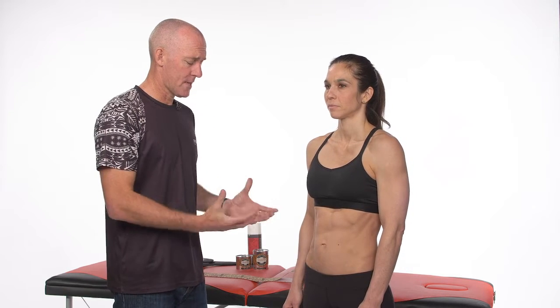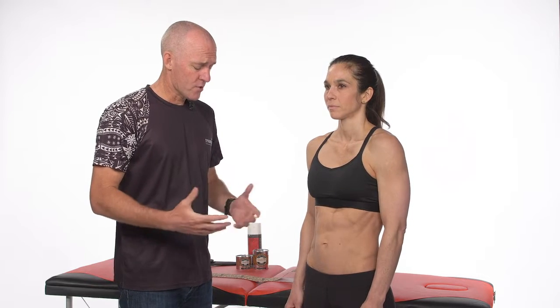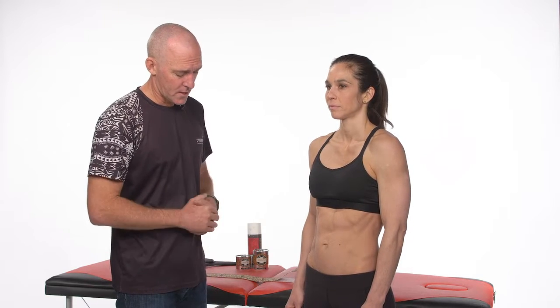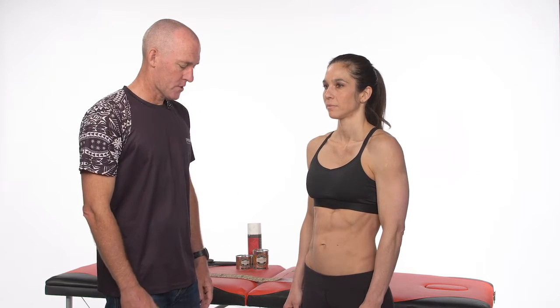So it may be indicated in a range of different people. We're seeing some research emerging on greater trochanteric pain syndrome, but it might also apply to ACL repair and reconstruction subjects, or even some medial shin soreness — anywhere we're looking at controlling frontal plane motion of the hip. Here we're also going to control or absorb some sagittal plane load, so they don't need to collapse in the frontal plane.